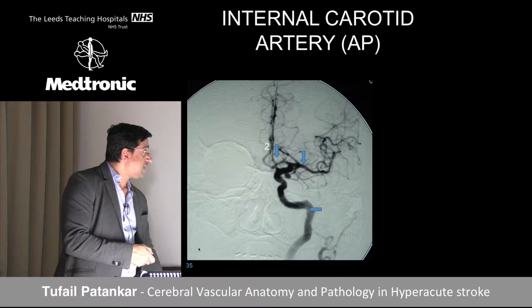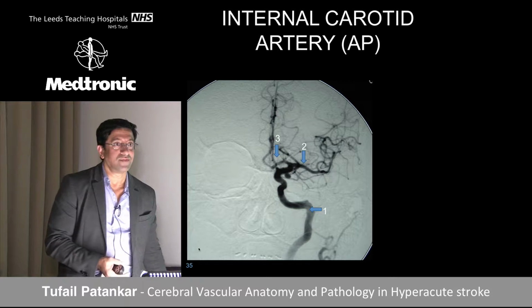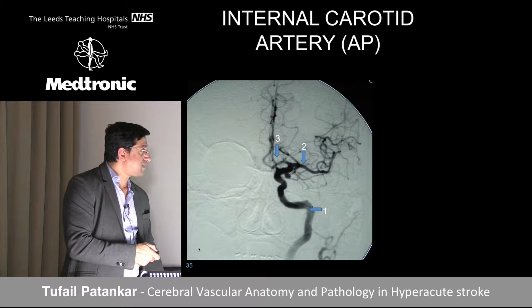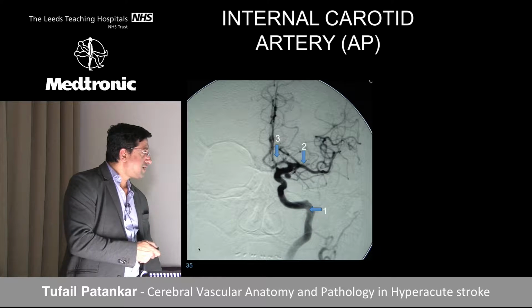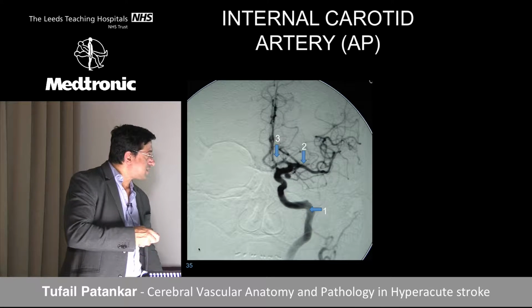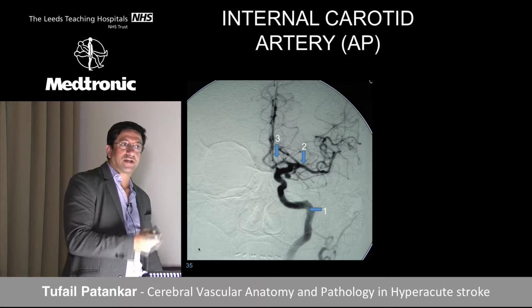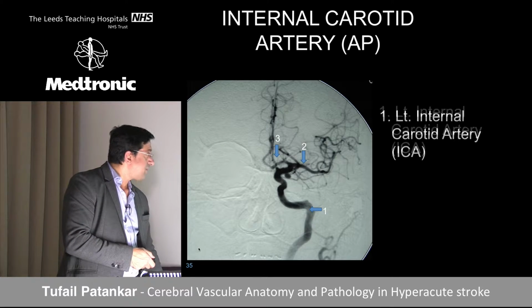When you look at an angiogram, you've got the internal carotid artery coming in. What's that? MCA, brilliant. And which segment is that? Cavernous? No, petrous. The petrous segment comes here and takes a turn horizontally. This is the foramen lacerum, where it is just at the top, and then it enters Meckel's cave there, and then it enters the cavernous segment, takes a turn around it, goes up to the anterior clinoid, and becomes the intracranial segment. So it's easy peasy.